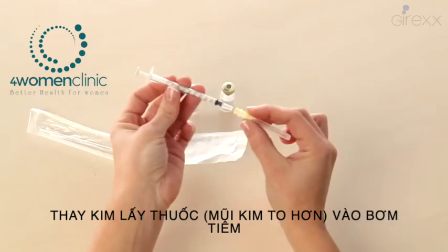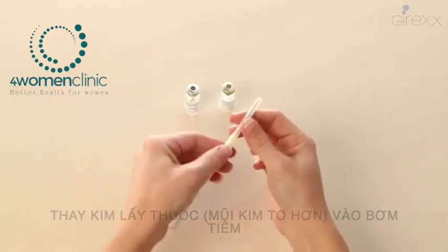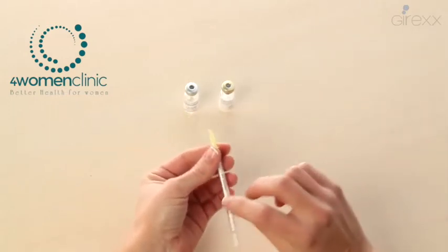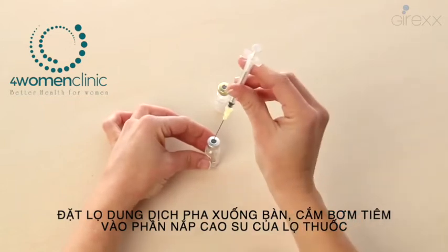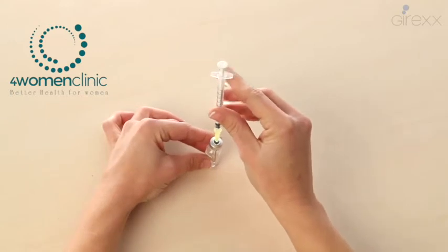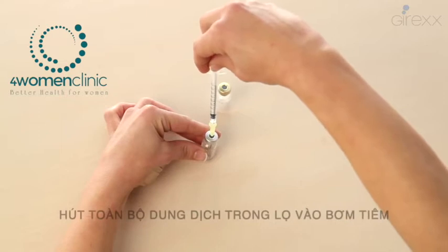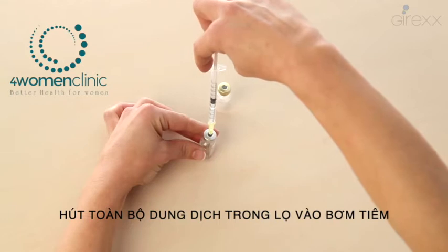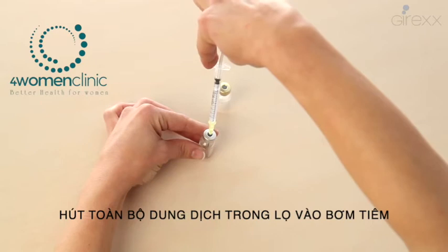Take the syringe with the big needle and introduce it into the dissolvent vial. Extract the liquid, tilting the dissolvent vial slightly so that you can extract all the liquid. Then take out the syringe with the needle.